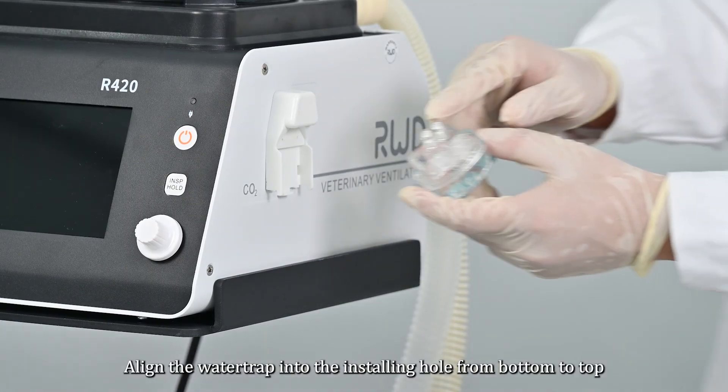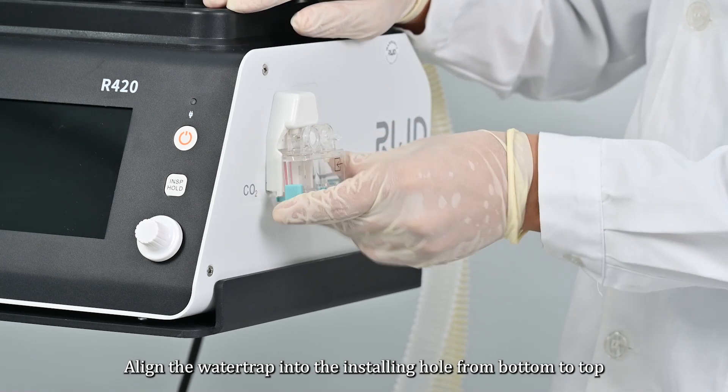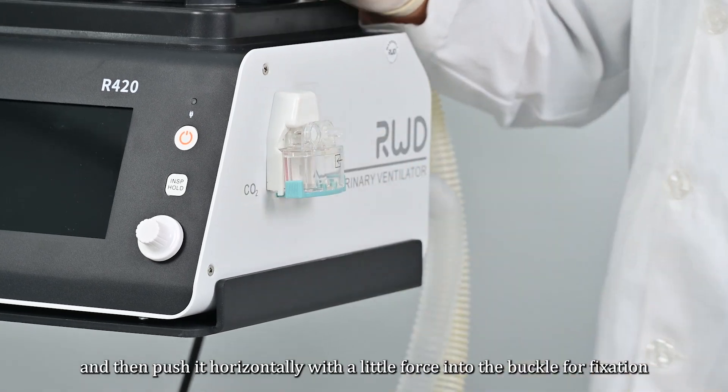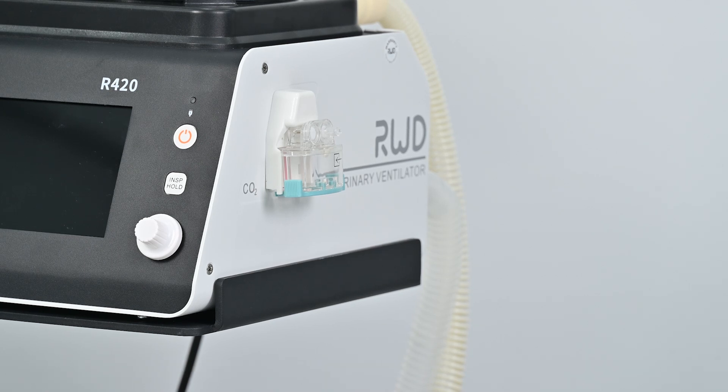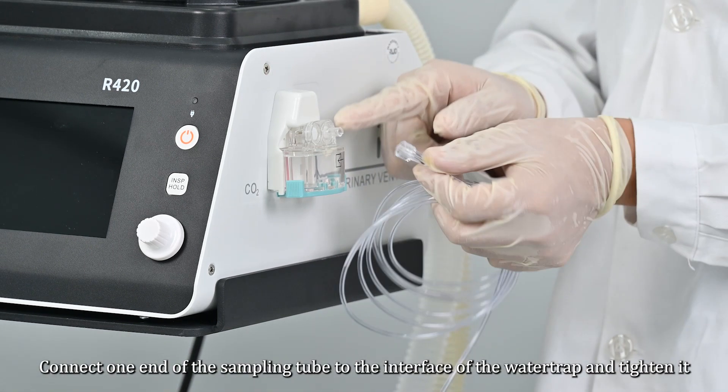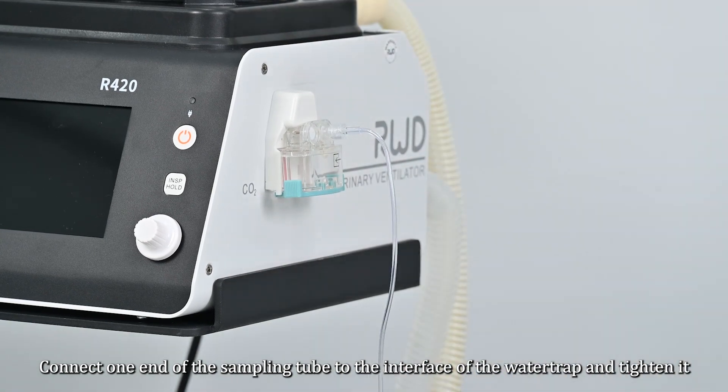For ETCO2 water trap installation: align the water trap into the installing hole from bottom to top, then push it horizontally with a little force into the buckle for fixation. Connect one end of the sampling tube to the interface of the water trap and tighten it.